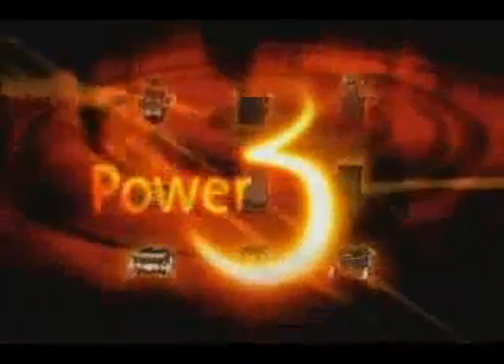Just imagine a power mobility solution that is truly tailored around the needs of the client. The power of excellence, the power of three.